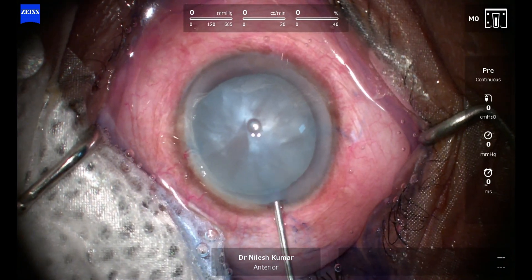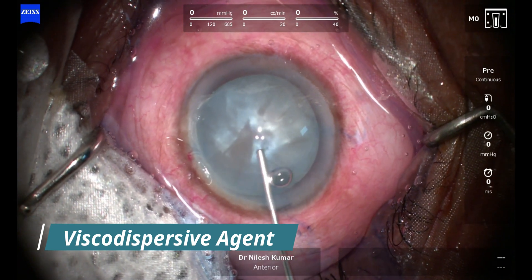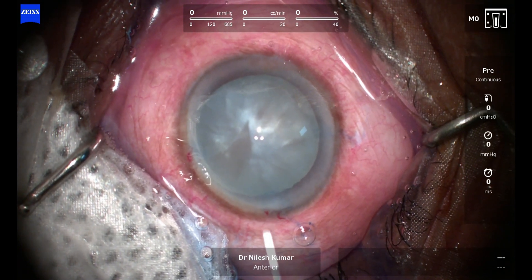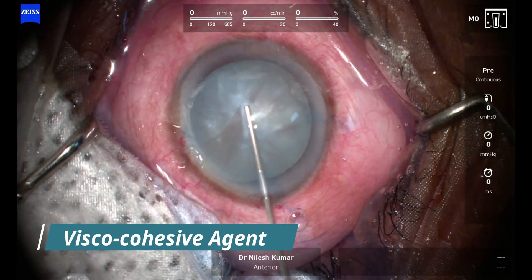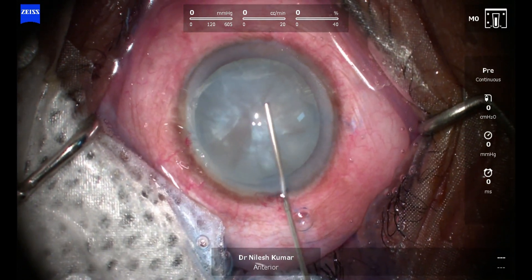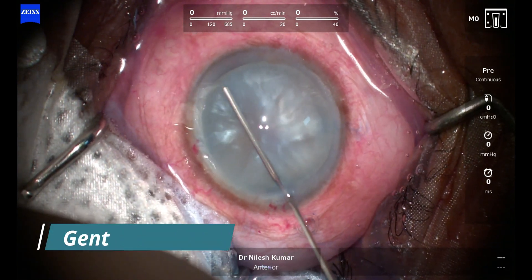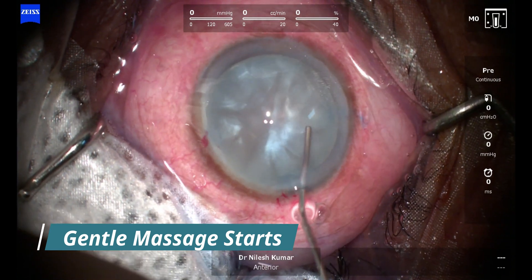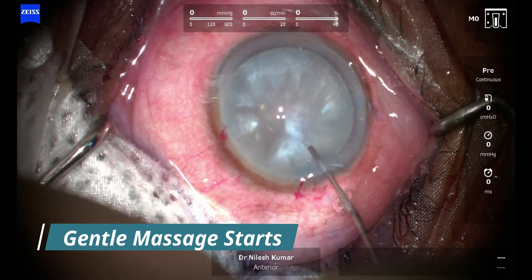This is our next case — case number two that I am just demonstrating. Same process: we are giving a bolus of viscodispersive followed by a bolus of viscocohesive, so this is the soft shell technique that we use. After that we will start the gentle ironing again — you can see it is not too stressful on the zonules.